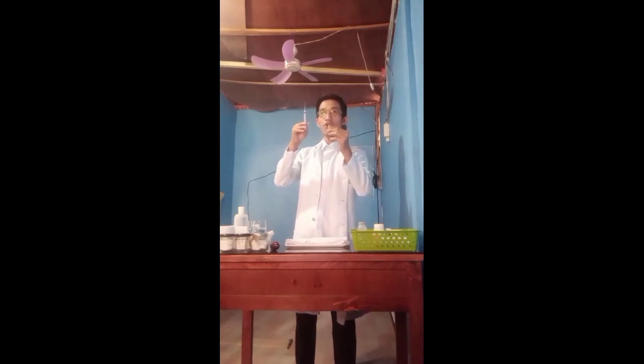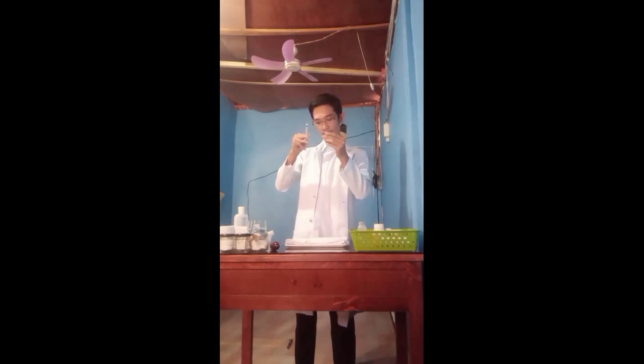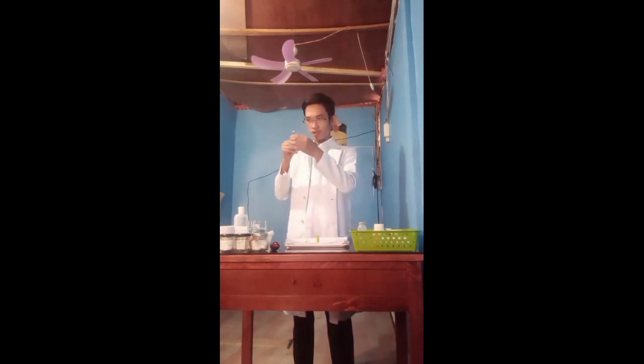So here, aspirate the medication into the syringe by gently pulling back on the plunger. So I'll put some air. So if this is 0.5, yes, 0.5. So put some air, 0.52. Okay, I have here.